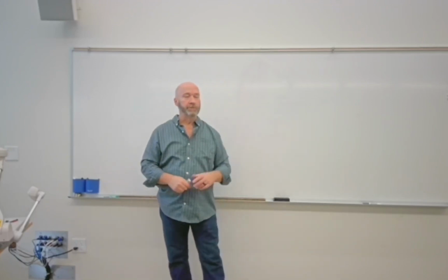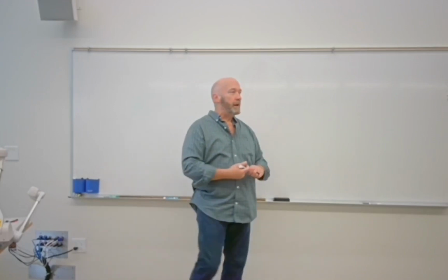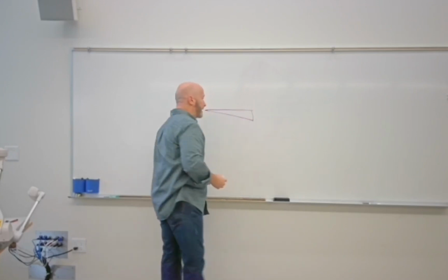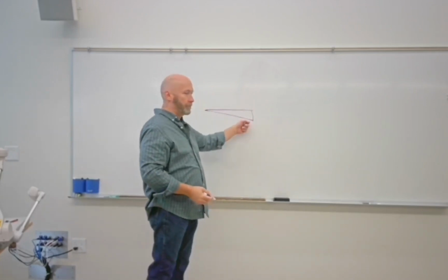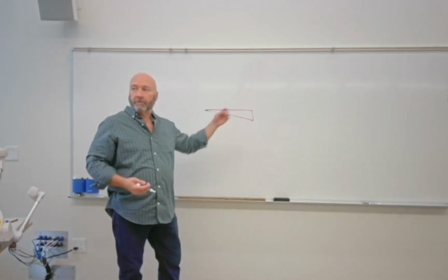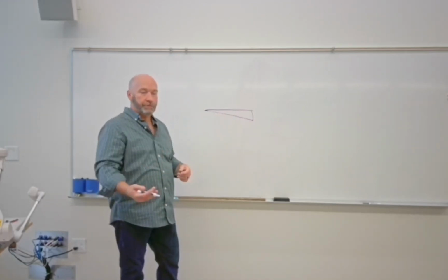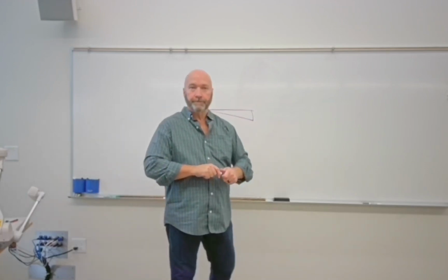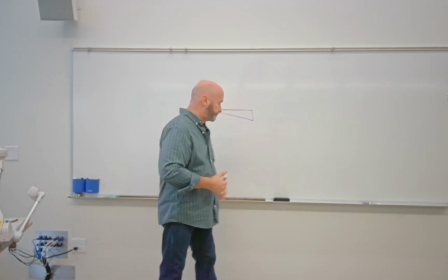You get more absorption, exactly. So if you have a tabletop that's not uniform thickness, let's say it's shaped more like that, then naturally you're going to have more absorption down here than up here, right? Which is going to give you an artifact on every image you shoot. So it has to be uniform thickness, but it also has to be radiolucent. So both of those things apply.